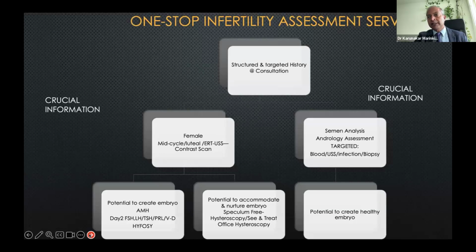Not to waste infertile couples' time, there is a model that I will be emphasizing on, one-stop fertility assessment or infertility assessment service that does involve structured history taking even before the patient comes, scheduling the ultrasound in the mid-cycle, which will allow assessment of the large component of the endocrinology. You can always do tube test at the same time. You can assess the myometrial endometrial pathology at the same time.